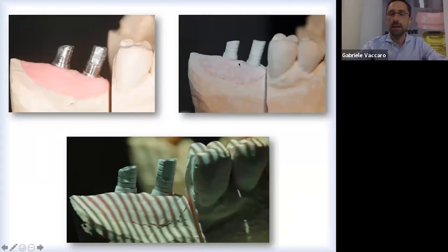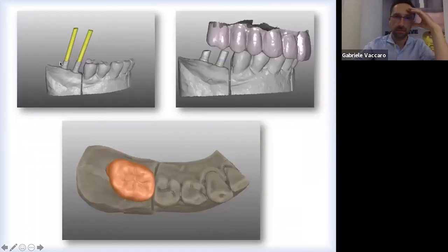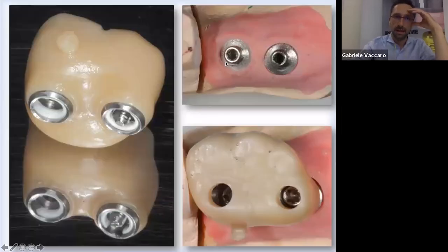After that, in the lab, they start the digital workflow for the realization of the prosthesis, the digital acquisition, and then the digital manufacturing. Then after that, we have all the digital pieces matched together. We have the shape of the crown, the shape of the cylinder that has the housing for the Seeger, and the spacer, because the cylinder must be cemented inside the crown. So this is the virtual cylinder with the spacer around it. The real cylinder, no longer virtual, cemented inside the crown, right here.